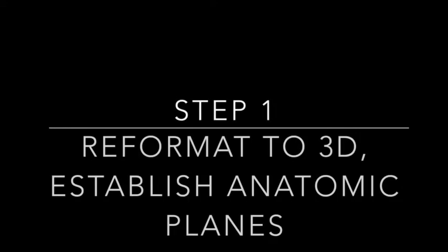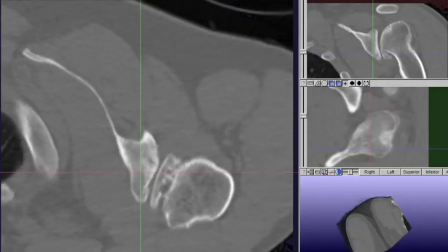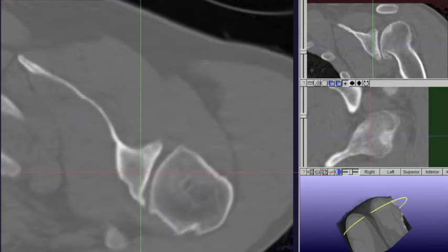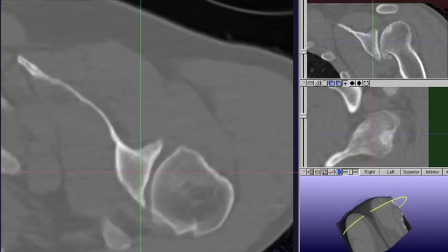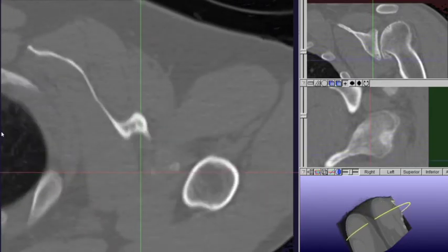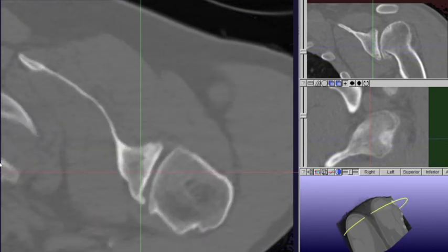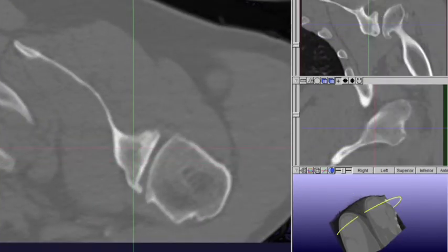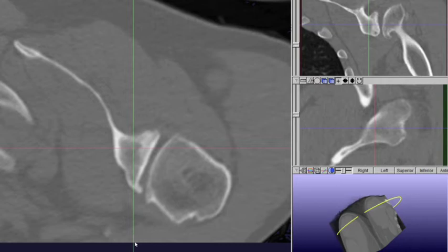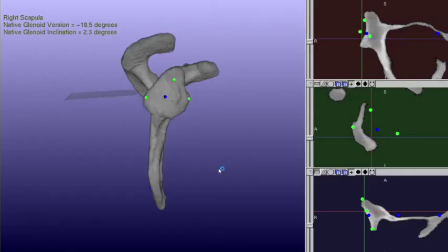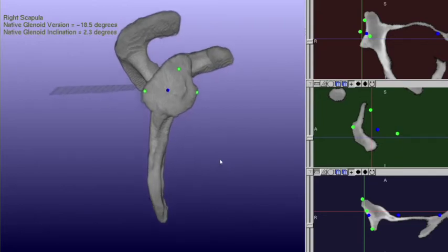Step one includes 3D reformatting. These first steps are often automated in most commercially available software. However, it is still important to understand the method behind image acquisition and definition of anatomic planes. Here you can see the axial plane does not appear to be a true axial plane — the coronal and sagittal planes are 45 degrees off the scapular body rather than perpendicular and parallel to it.